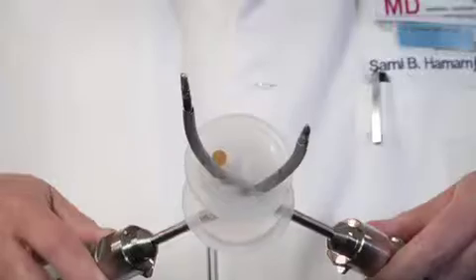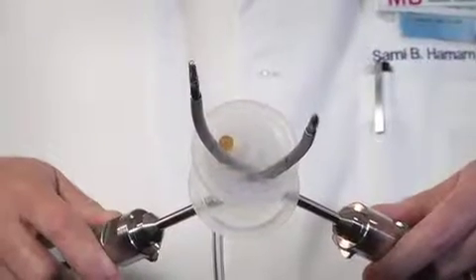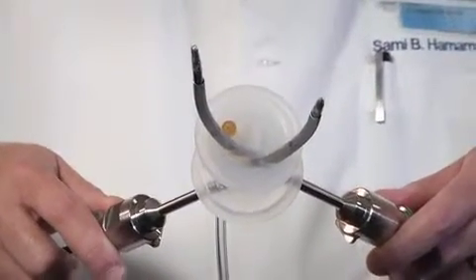So if I were to control these instruments, my hands would be crossing, or my brain would be wondering which hand I'm using in order to control which instrument. Obviously, I can get used to it. But having the robot do the flip, then we don't even have to worry about that, and we don't have to keep thinking which hand we're going to use in order to control which instrument.